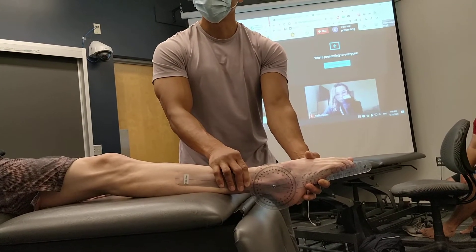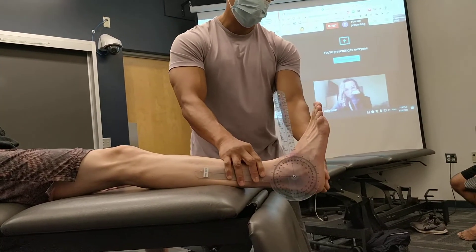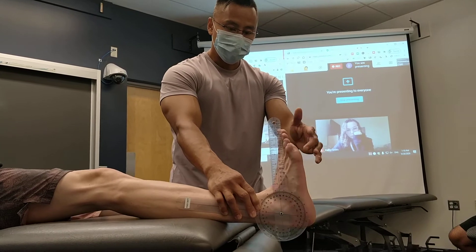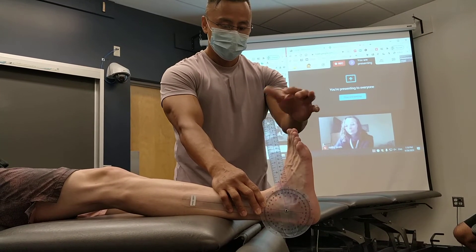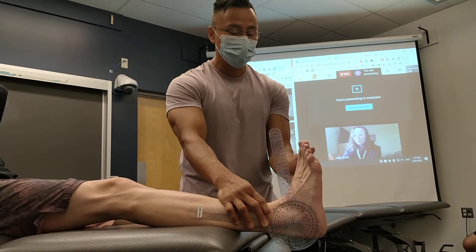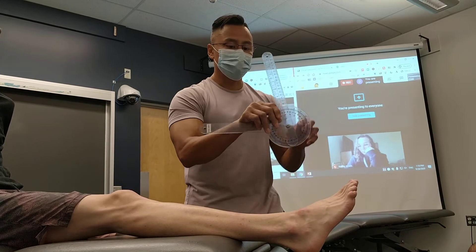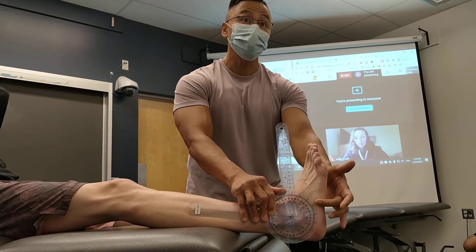I hope that makes a little more sense. We'll go back up to zero. Now, similarly, we can use — ideally not the shaft of the fifth — but the plantar surface or the calcaneus. Eyeball it. I think the plantar surface is 90 degrees because my goniometer is 90 degrees and it looks relatively close. So now we're going to dorsiflex. At this point, I didn't use the base of the fifth — I'm just using the plantar surface of the calcaneus. Patient dorsiflexes; I follow the calcaneus. Really, it's zero plus the amount of range of motion you want into dorsiflexion. As long as you keep it parallel, that's when you can use zero plus 15 degrees off the scale on the goniometer. Because it started at zero — or 90 — then it moved 10 degrees, so it's 10 degrees into dorsiflexion. But that's another way to do it. If you want to stay parallel with the foot the entire time, you can do that. You don't have to use the adjusted zero for the base of the fifth.